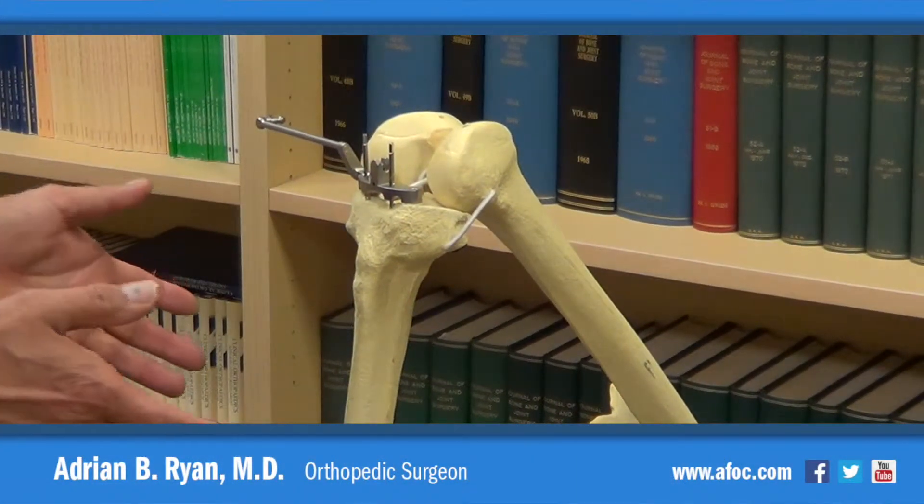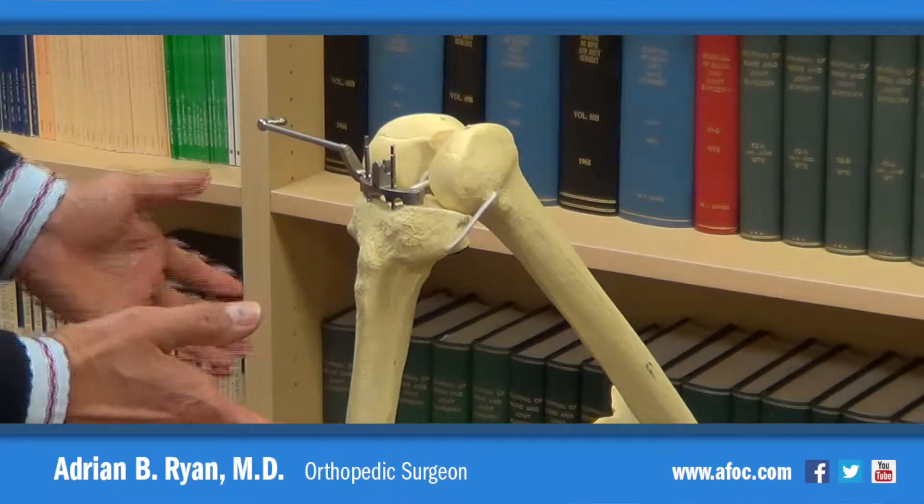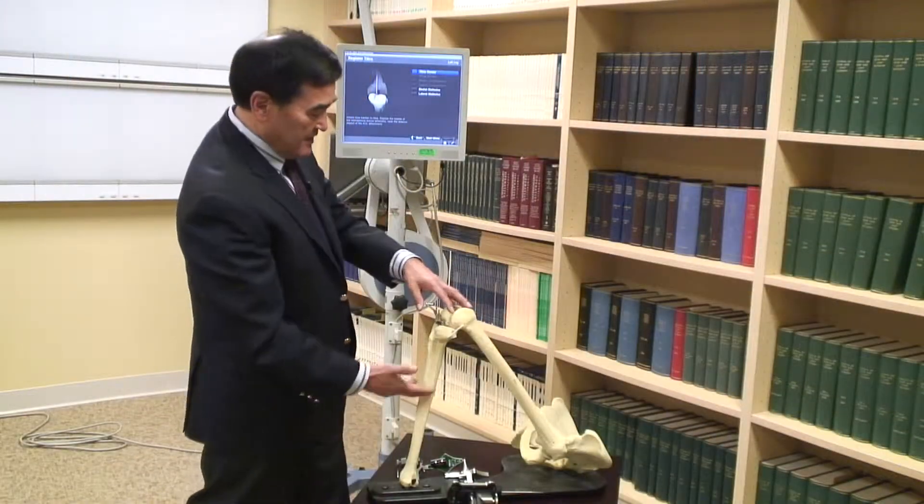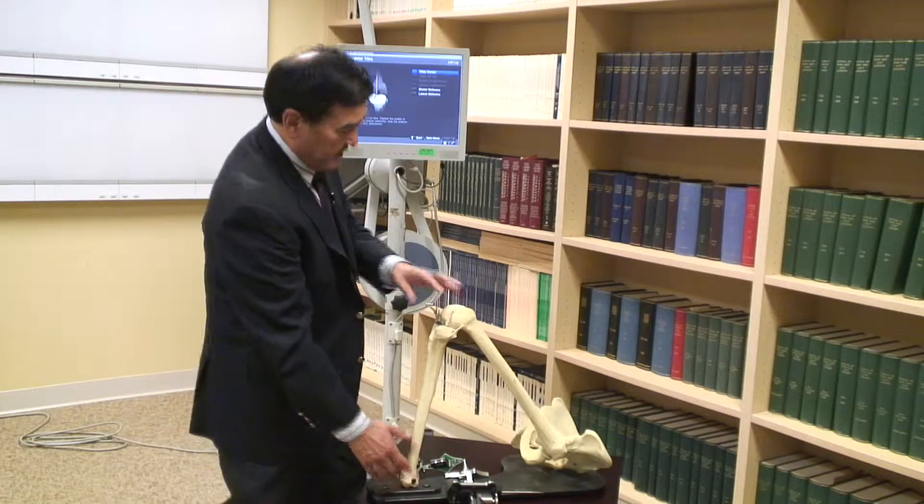In this demonstration, this is someone's left total knee replacement. In this model, this is a femur — the hip is way up there, the tibia is here, inner ankle and outer ankle.